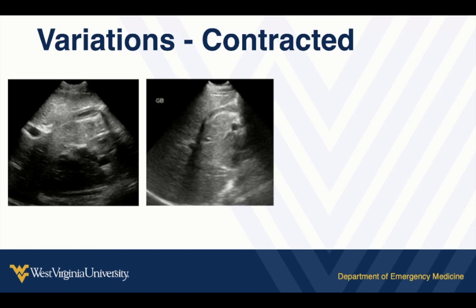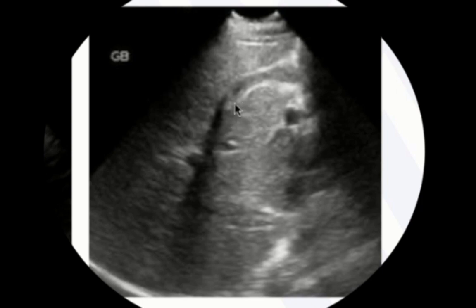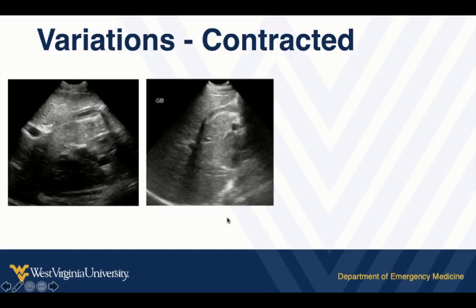If you're examining a patient who just had a chicken dinner, they may have a contracted gallbladder — a bit more difficult to identify, but with practice and landmark recognition you can find it. In this example: liver parenchyma, portal vein, and here's the outline of the contracted gallbladder. When contracted, the wall can look falsely thick, but you still see a nice clean white border. Inside is just the contracted muscle with an edge shadow that, as you fan through, always stays on the edge.